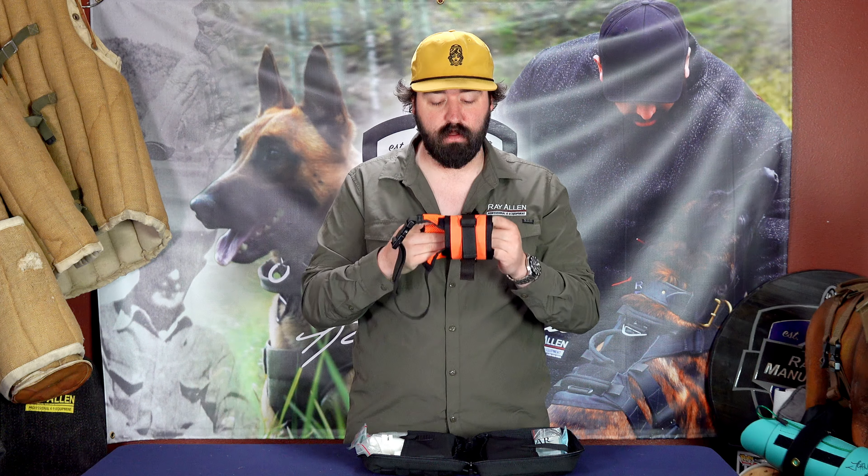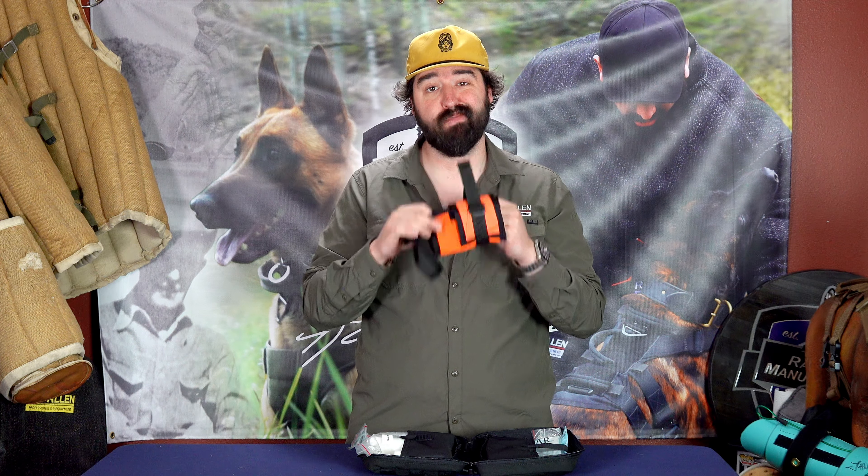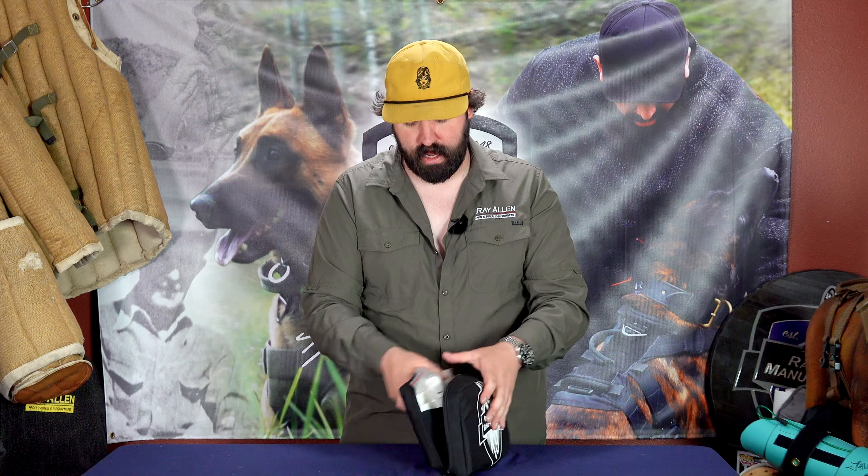You can fully adjust it — fully adjustable head strap — and this is a great little mesh muzzle to put on your dog, and now it comes in bright high-vis orange. You can throw it in the med kit, it shrinks down real easy, you don't have to worry about it, and then when you do need it, you can pop it open and there it is.